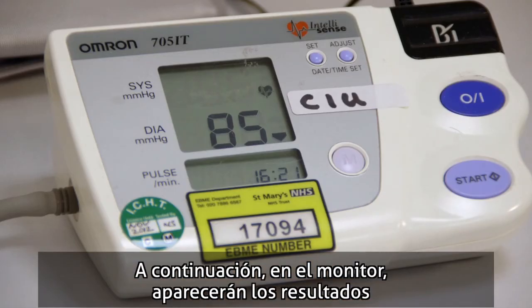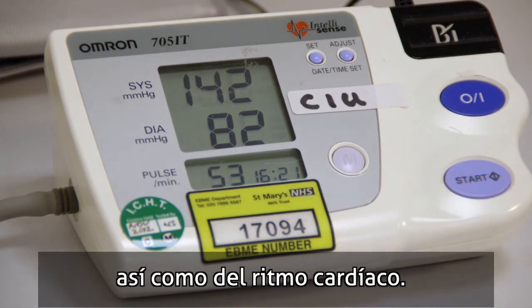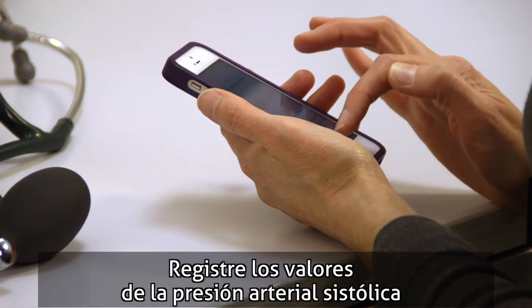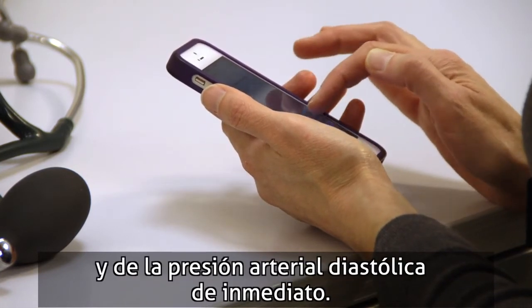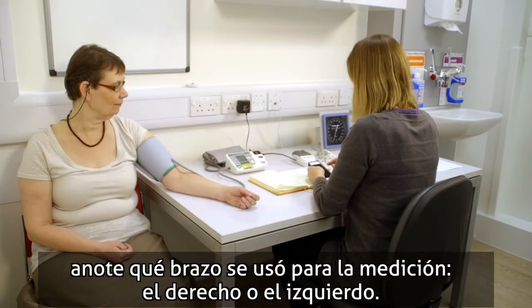The monitor will then display the readings for the systolic blood pressure, diastolic blood pressure, and also give you a heart rate reading. Record the SBP and the DBP numbers immediately — don't depend on memory. Note the arm, right or left, used for taking the measurement.